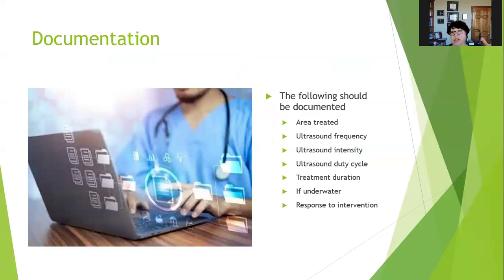We're going to document the area treated, frequency, intensity, duty cycle, and treatment duration. We're going to say whether it was underwater. You don't usually have to say if you used coupling gel because if it wasn't underwater, then it's assumed that you used coupling gel. And the patient's response to the intervention, especially if you have to terminate the treatment early because the patient had an adverse response. If the patient says, "Oh, that feels stingy," or zappy or something like that, stop the treatment. If they say it feels warm, yay, that's what you want if you're doing a thermal treatment. If they say, "I don't really feel much except you just moving the sound head on me," and you're doing a non-thermal treatment, that's fine.